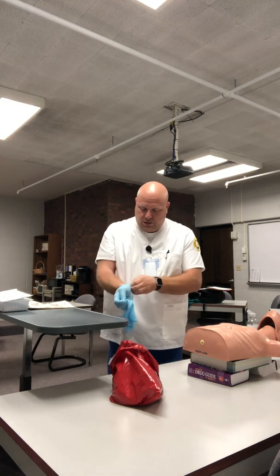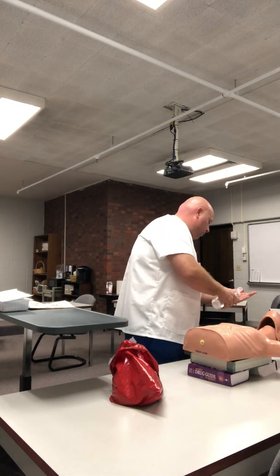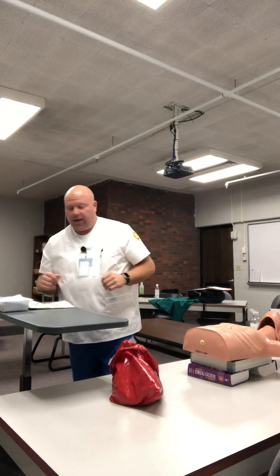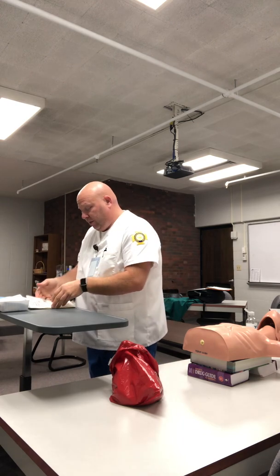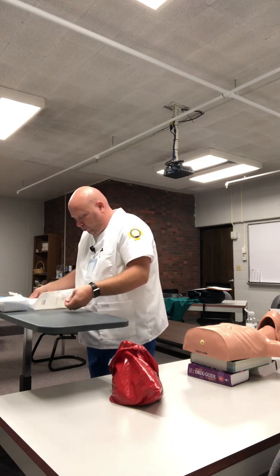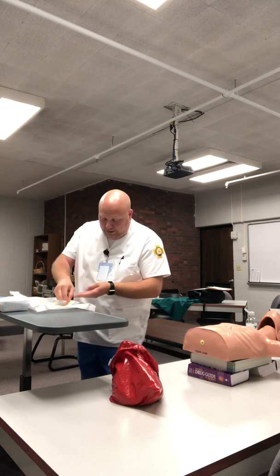Take off my gloves. Toss in the trash. Perform hand hygiene again. I want to pull the top back off of my kit. I'm going to perform hand hygiene just one more time. And I'm going to put on my sterile gloves. We'll put my left one on first.